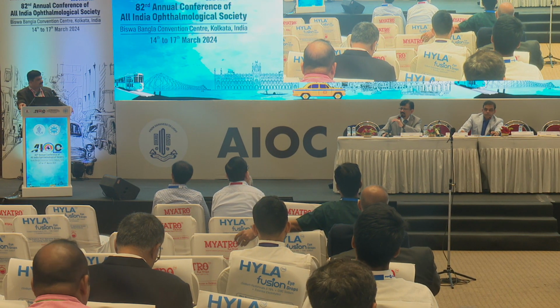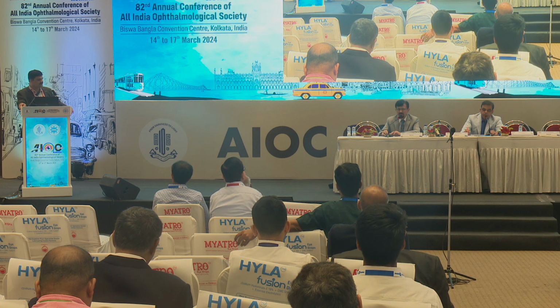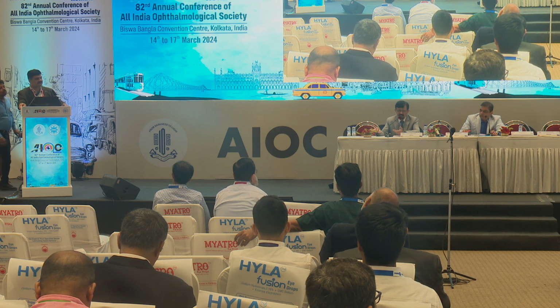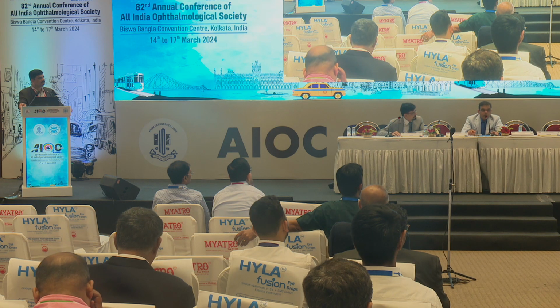No, the question is not whether you do it or not. The point is whether there is any risk of flap buttonhole or not. It is doable, but the risk is there. With the SBK microkeratome, I still do till 48. I didn't have any flap complications.